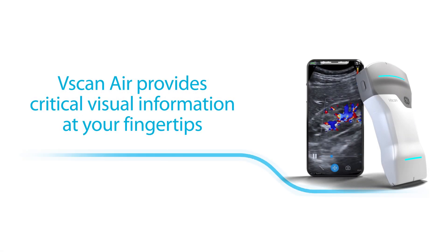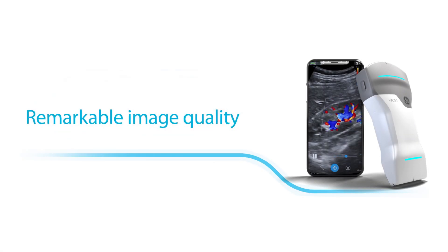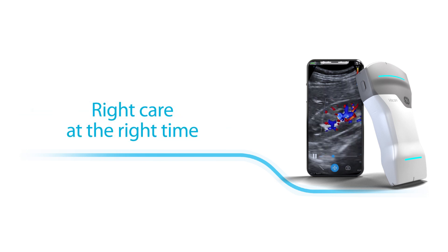vScan Air provides critical visual information at your fingertips with its remarkable image quality, ensuring your patients have access to the right care at the right time.